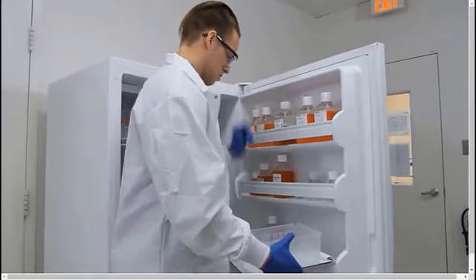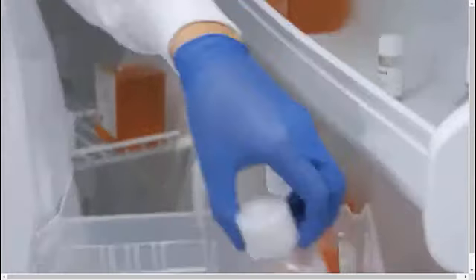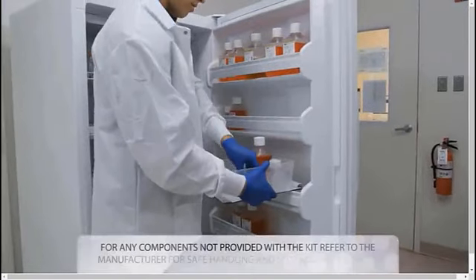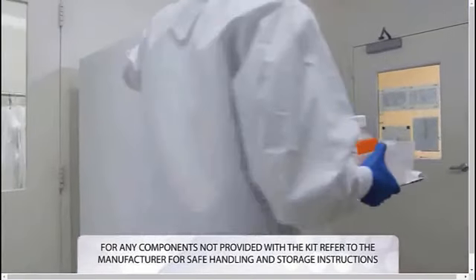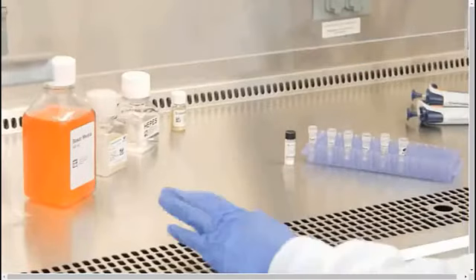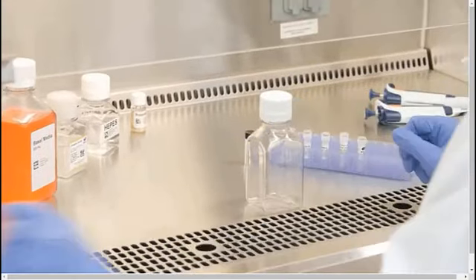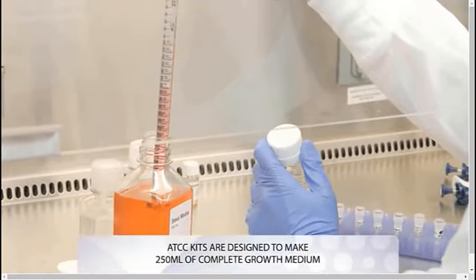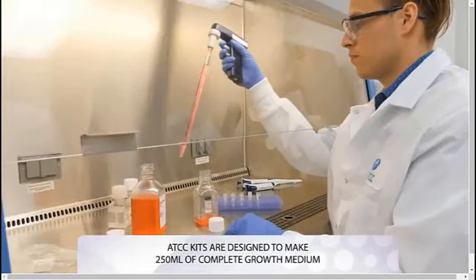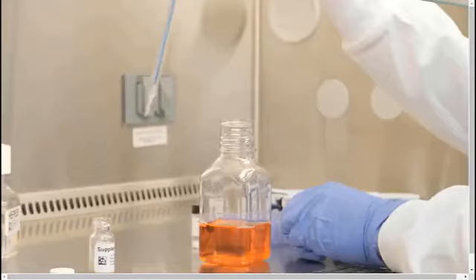These reagents should be thawed in advance if needed. Start by preparing any components not provided by the kit, including basal media, buffer agents, glutamine, and other supplements.